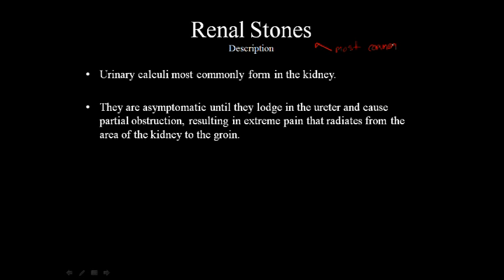But depending on your population density and the type of patients that you have, you're going to see a lot of patients that either have a history of renal stones, or you're going to have a suspected renal stone being lodged somewhere.